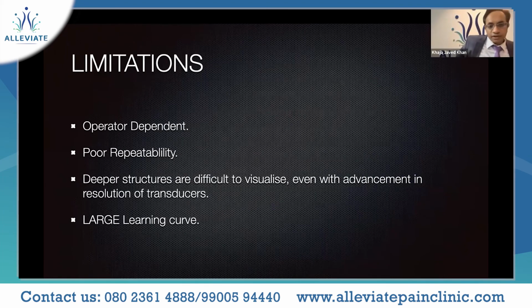Let's have a look at the limitations of the ultrasound. One very important thing is that operator dependence is paramount, right? Next, there's poor repeatability with the ultrasound. Once you get an image, many a time getting the same image again would be difficult. Of course, it depends on operator variability. The deeper structures are often difficult to visualize, even with advancement in the resolution of the transducers. And remember, ultrasound always has a large learning curve. It requires quite a lot of expertise, right? So the more you keep using the ultrasound, the better you become at it.